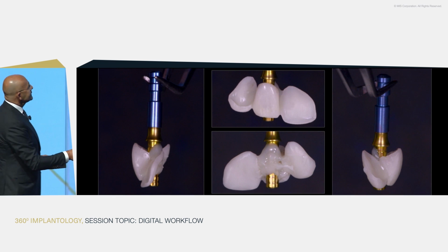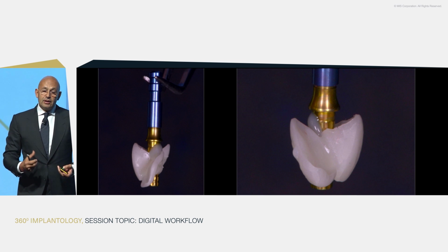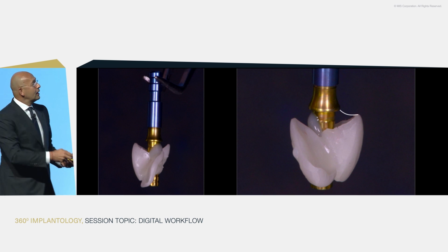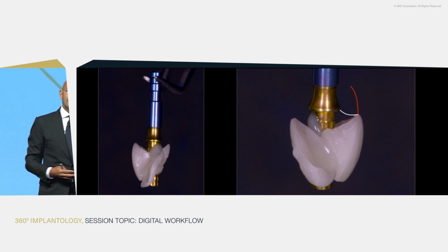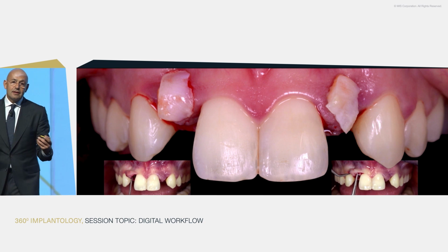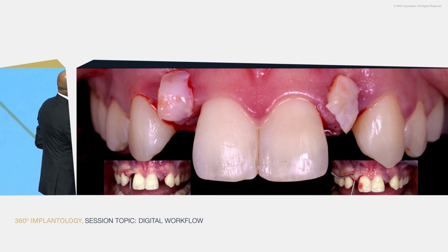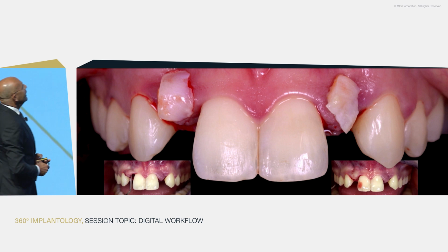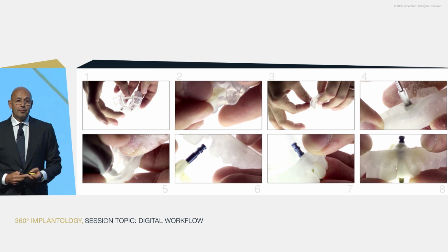However, when we look at it from the side, the missing part, which is here, has to be filled. So one part has to be filled by us in the prosthetic section, and the other side has to be filled out by the surgeon by placing more connective tissue grafts to balance it. So thank God we have this guide of the wax-up to start with, so we knew where we were going from the beginning. Eric is placing the soft tissue grafts now according to our design. And after this, simply, this is what we do with my dearest Hilal.